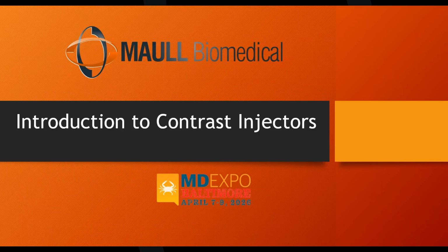So how this works, let's pretend it's film. It's the easiest way to think of this. There's film underneath the table, right? Patient's lying on the table. So the X-rays that come out of the X-ray tube, we're going to fire the X-rays. All the X-rays that come out of the X-ray tube go into the patient. It's not 100% true, but for our explanation, we'll just go with that. So the radiation goes into the patient.